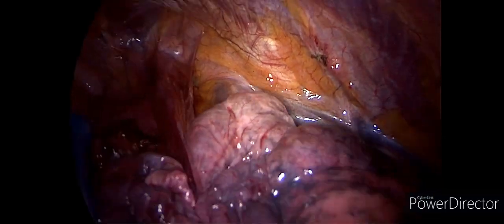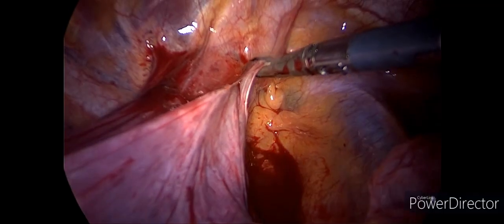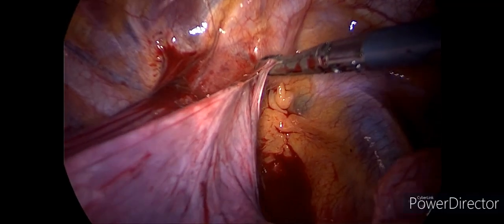Our last few adhesions were found at the apex, and these were taken down.